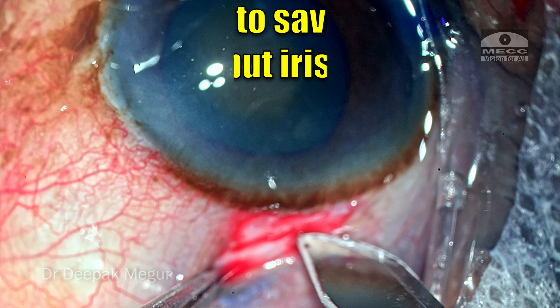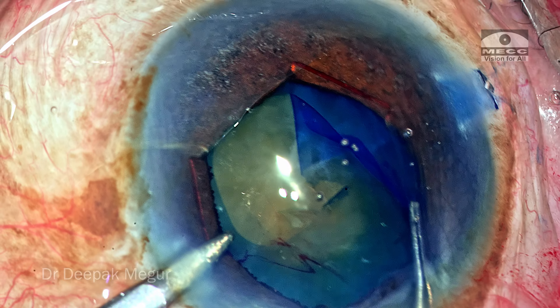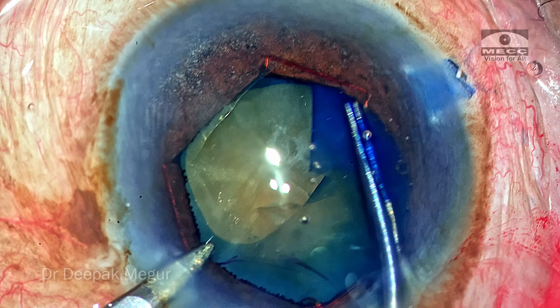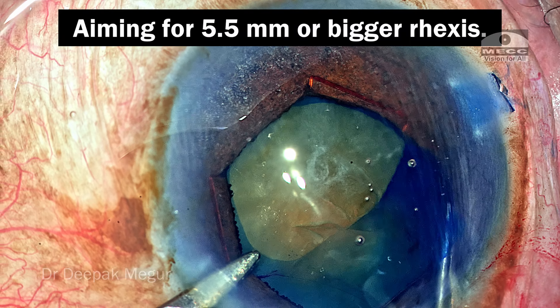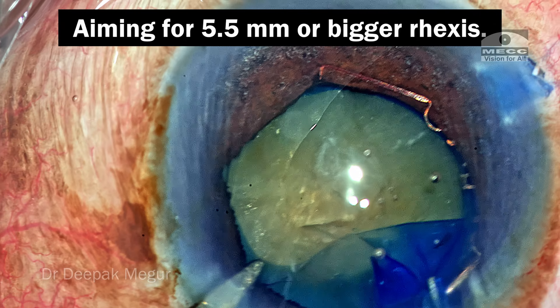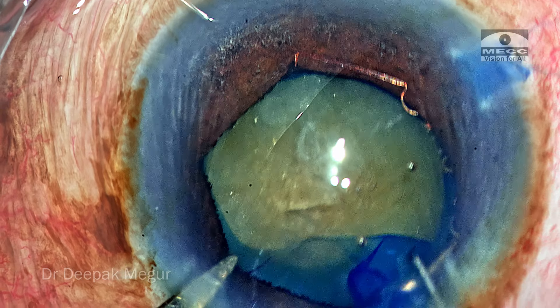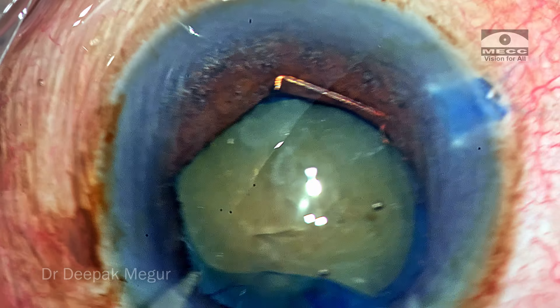This is confirmatory of extremely loose zonules. In eyes with loose zonules, I always prefer to go back to my forceps to grasp the flap and then begin tearing. Forceps adds great value in these scenarios. The goal is to perform at least a 5.5 mm rhexis and not less, because I am dealing with a dense nucleus — it is always easier and safer to have a bigger rhexis.